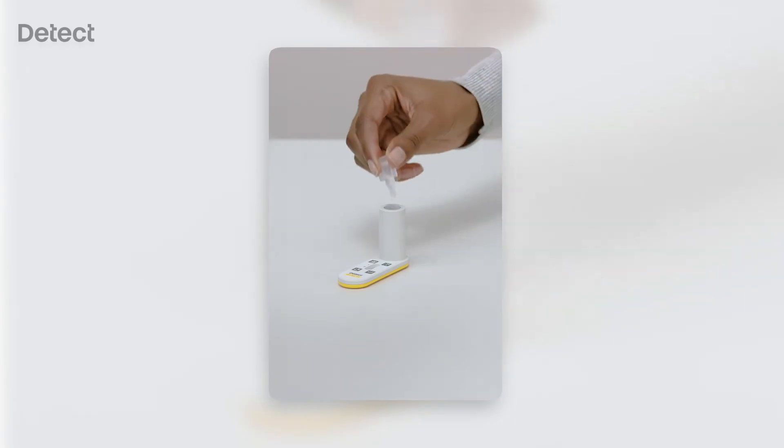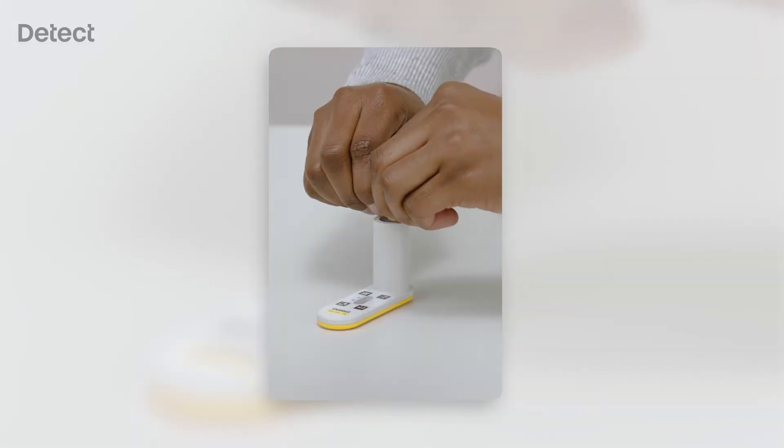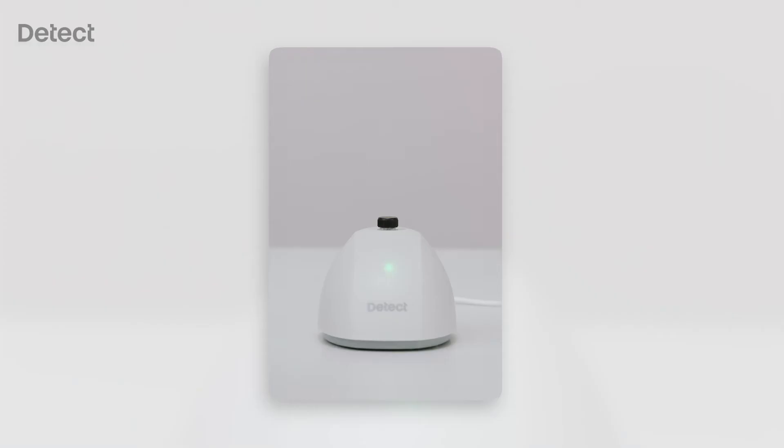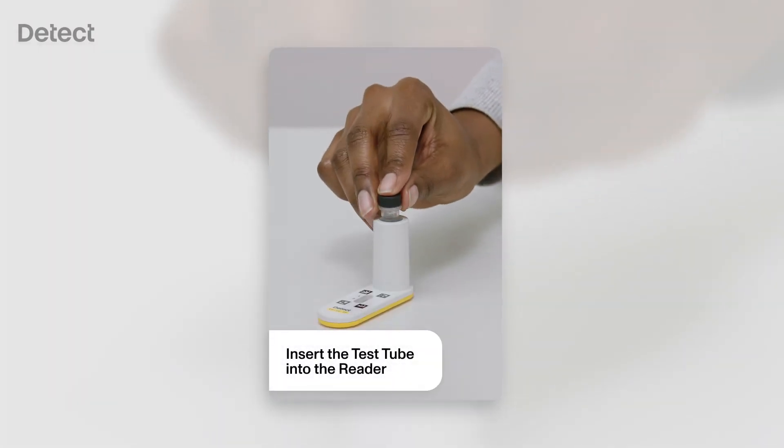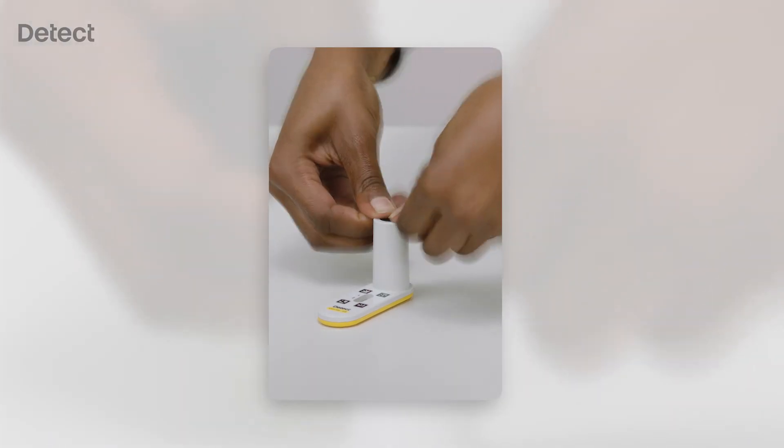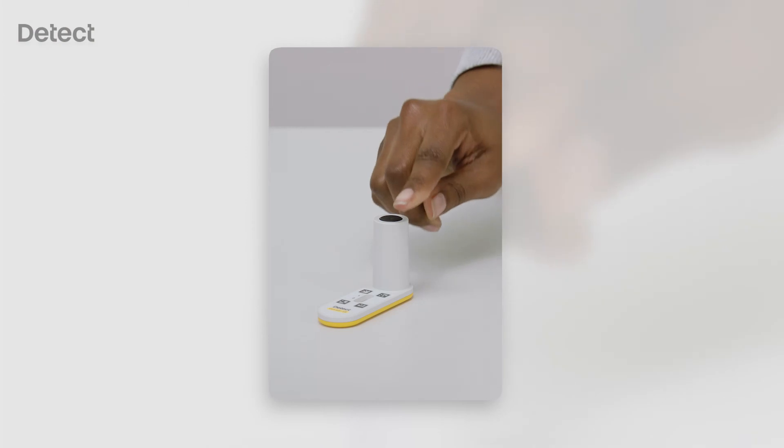Insert the dropper tip first into the reader chimney. Squeeze the dropper to dispense the liquid, then discard the dropper. Remove the test tube from the Detect Hub once the processing step is complete. Place the tube into the reader chimney, pressing down firmly with both thumbs. You may hear a pop as the reader pierces the tube.